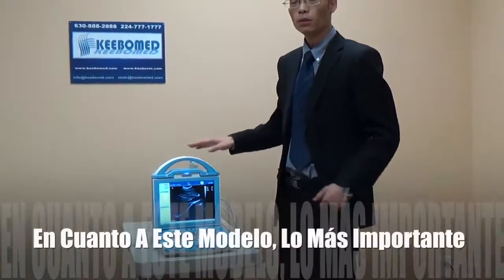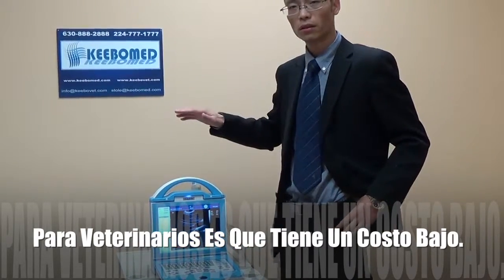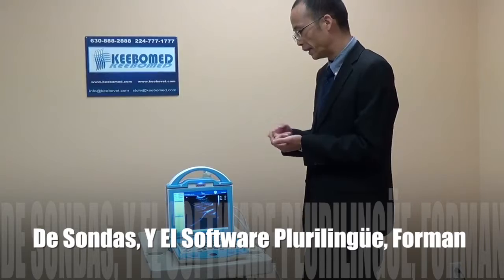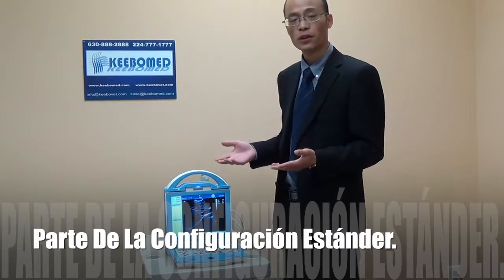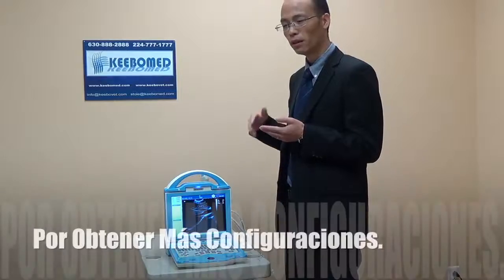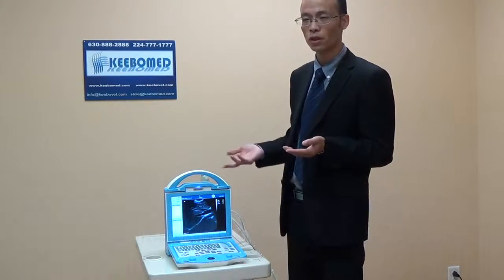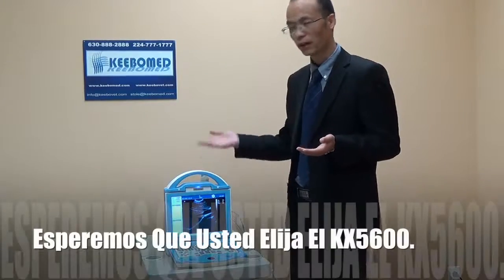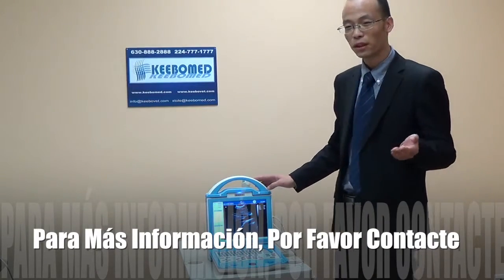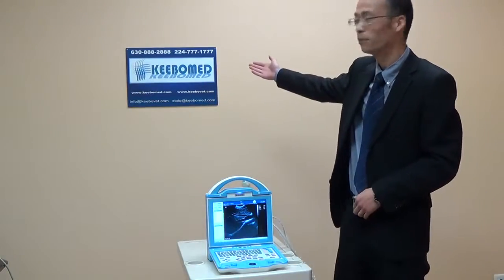The most important advantage of this model for veterinarians is the low cost. As I introduced, the battery, DICOM, and two probe sockets are all standard configuration. That means you spend very little money but get more features that will be very useful for your work. I hope you will consider selecting our KX5600 and enjoy your experience with it. For more information, you can contact our local distributor, KITMAP. Thank you very much.